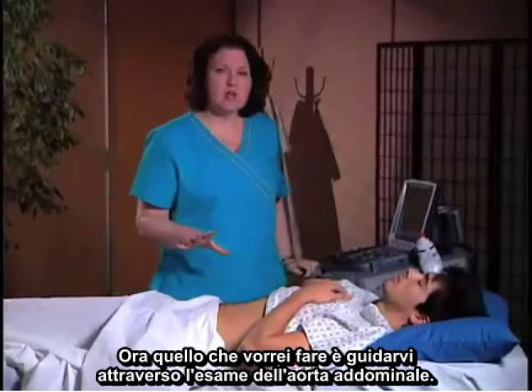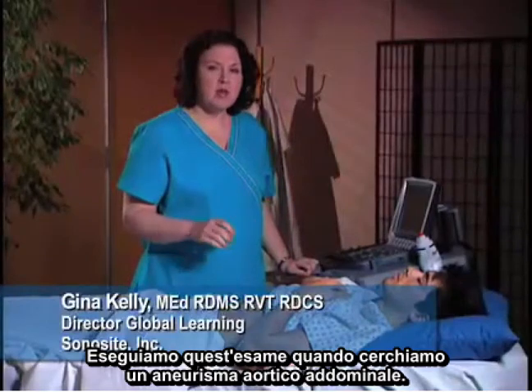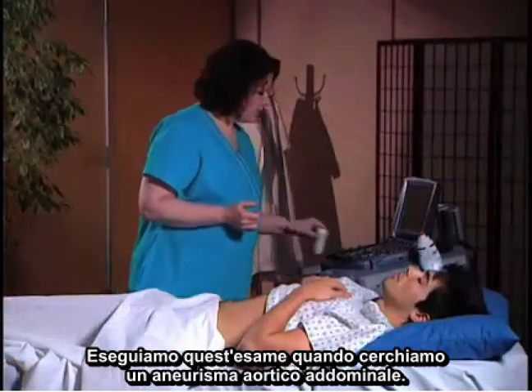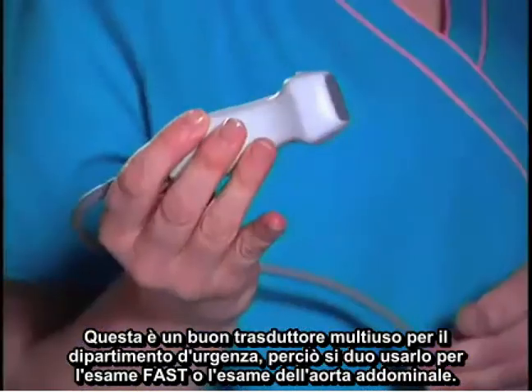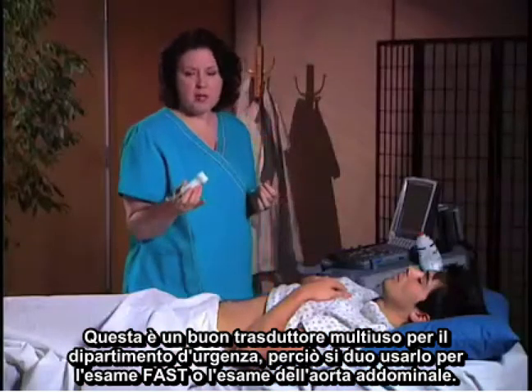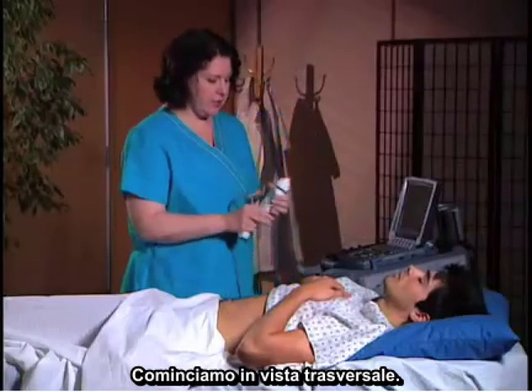So what I'd like to do now is walk you through the abdominal aortic exam. We do this exam when we're looking for abdominal aortic aneurysm. We're going to use a phased array transducer. This is a good all-purpose transducer for the emergency department, so you can use this for FAST exam or abdominal aortic exam. We're going to start in a transverse view.